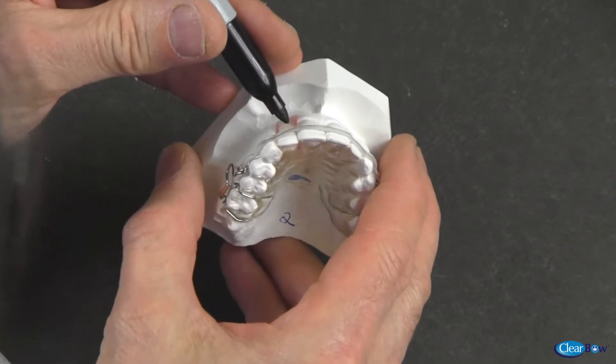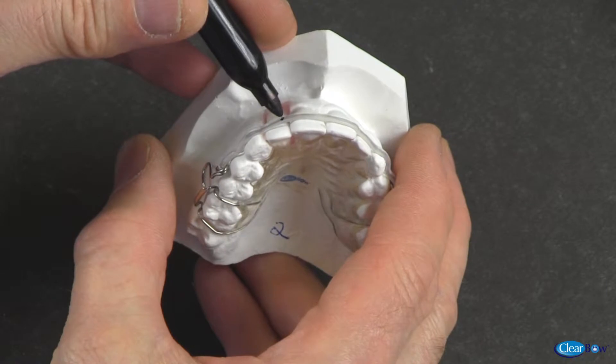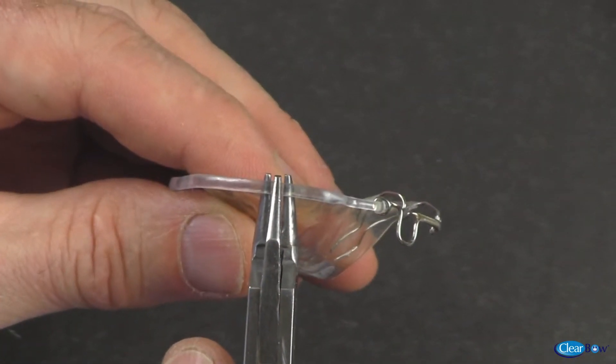The clear bow will now be bent using three-pronged pliers to contact the mesiolabial corner of the rotated lateral. A black dot is marked on the clear bow to make the bend more visible.